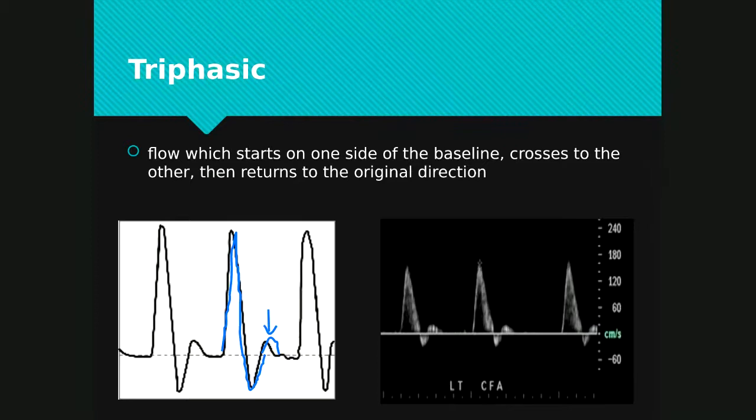So there's two display types, and if you remember from the last lecture, the one on the left here that displays the information as an averaged value or velocity over time was created by a continuous wave system, and this is an analog display, right?